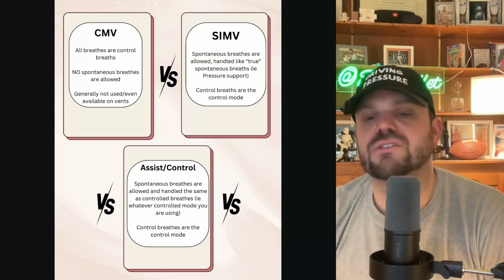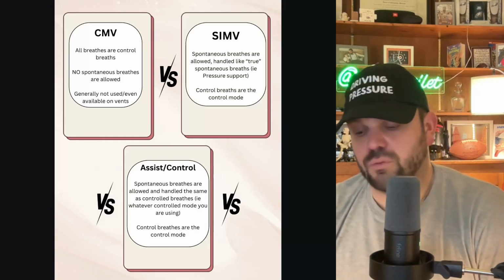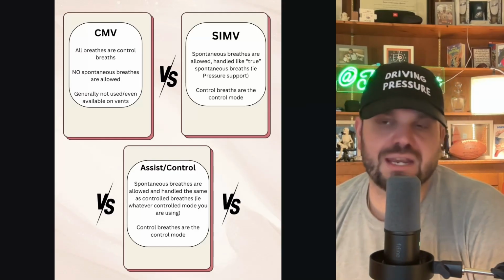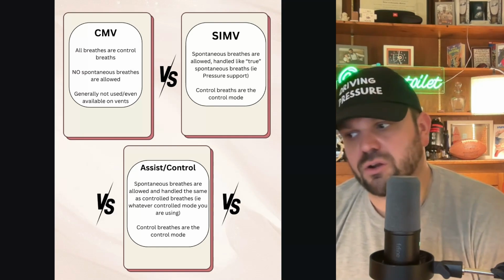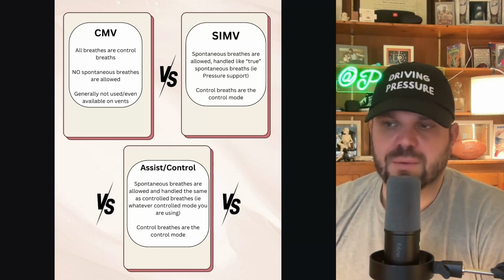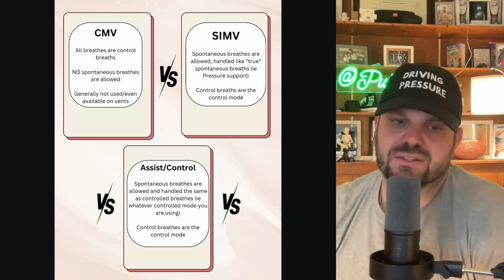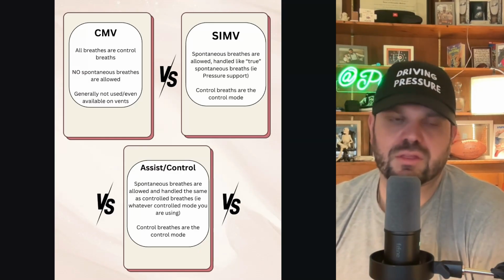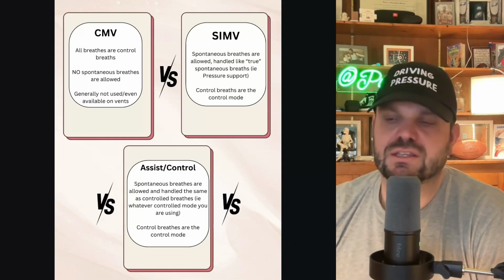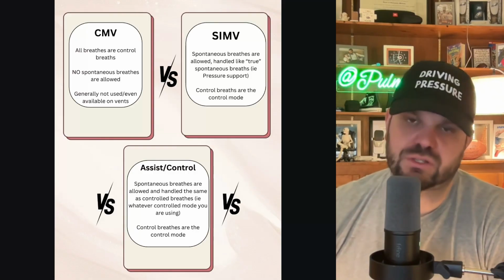I don't think there's any reason to use SIMV, because you can either use pressure control, or the control mode, whatever that is. And then if you think that they want to breathe spontaneously, some proponents say SIMV helps patients breathe spontaneously better or something of that sort. If the patient's breathing spontaneously and you have no other concerns, then just let them breathe spontaneously and switch them to pressure support to begin with, so they can control the inspiratory time in each breath, and not have the controlled breaths that are confusing their brain.